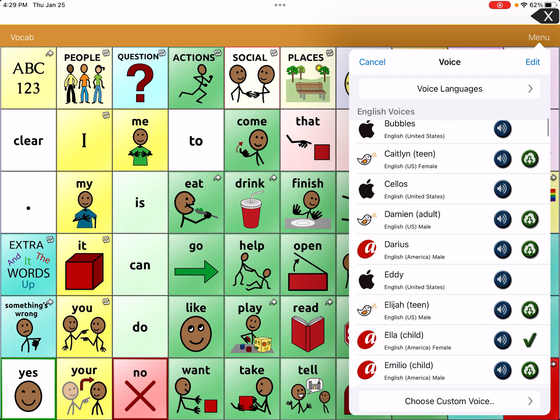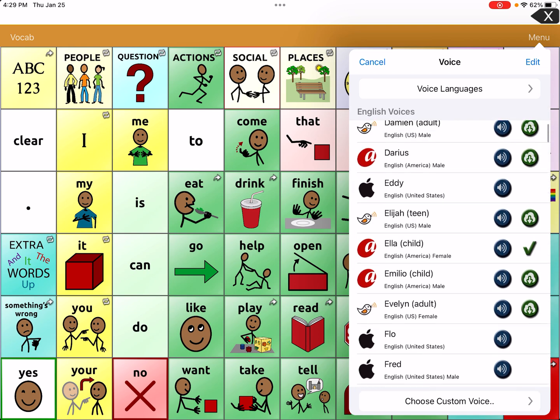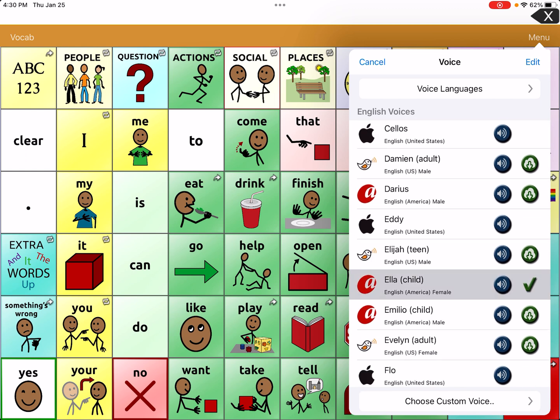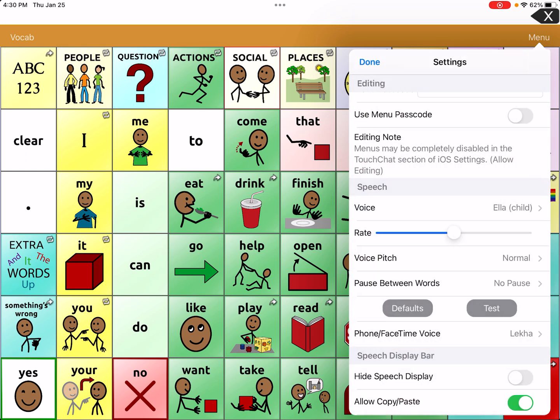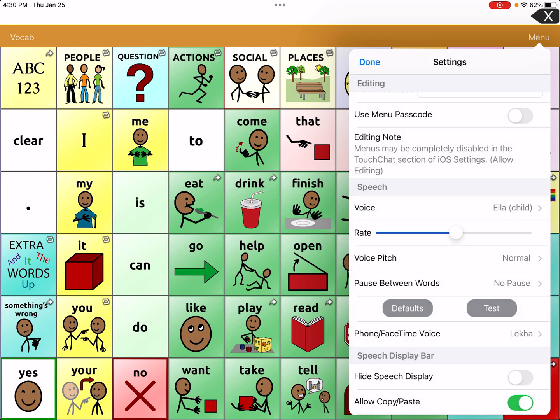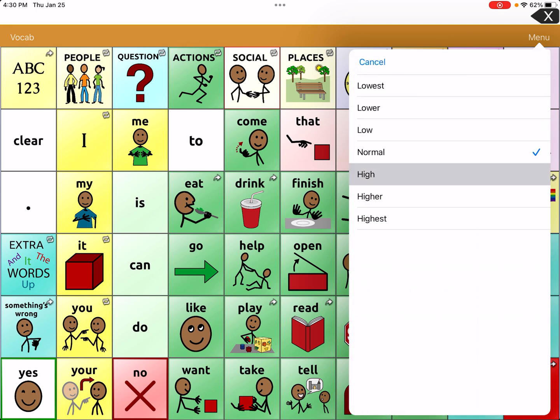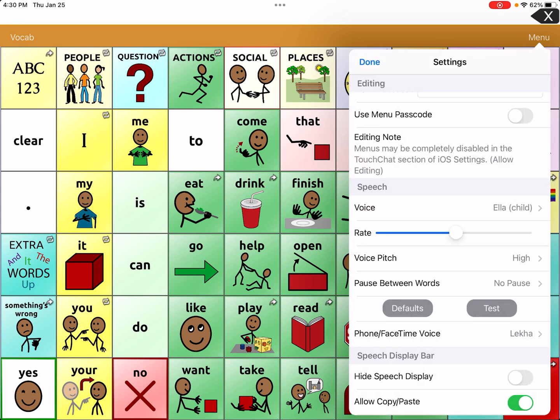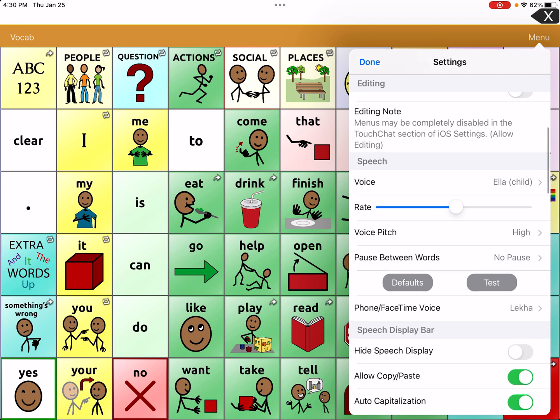After you find a match, let's stay with Ella here. I can change the rate to be faster or slower, and I can also change the pitch. So if I like an older voice, I can have that voice and then have the pitch be higher so that it sounds more like a child, and then keep that voice and change the pitch as the student grows. So that is also another option you can work with.